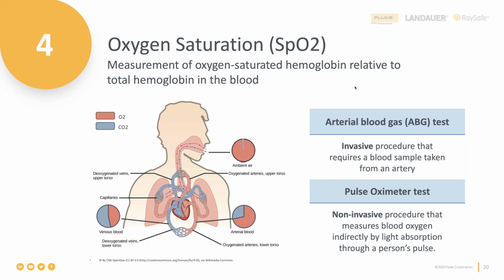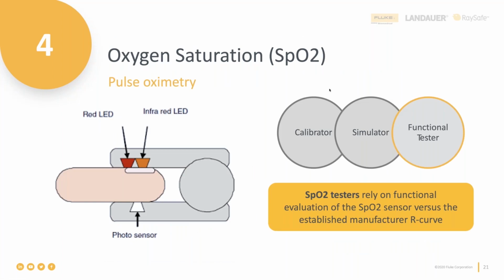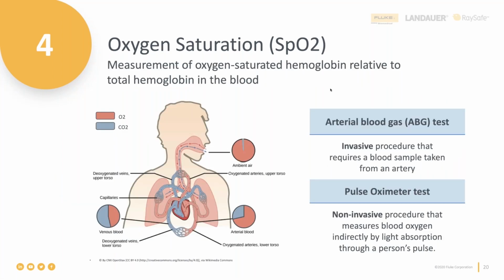This technology quickly monitors heart and lung function, to check that arterial blood is carrying oxygen to the body's cells. That's the main function that you're checking for. Typically, a finger or another peripheral part of the body is used to pick up on the pulses of blood from the heart. And the parameter you're actually measuring is referred to as SpO2, or the saturation of peripheral oxygen. So with that definition, we'll move on to the technology.